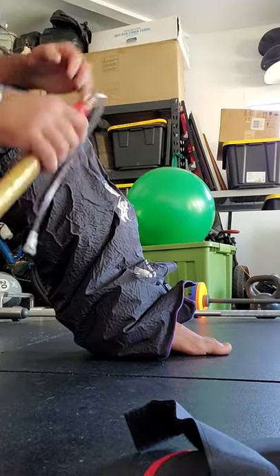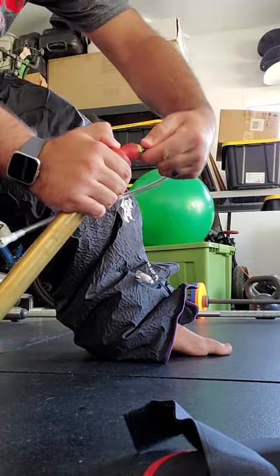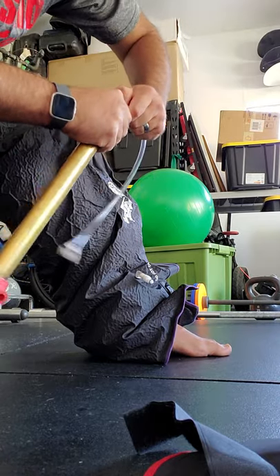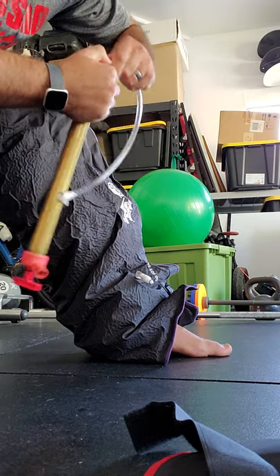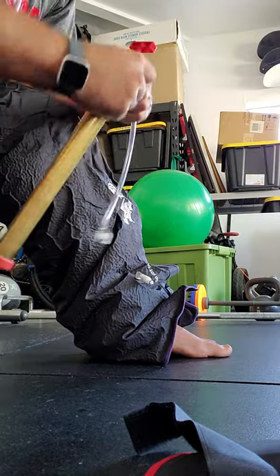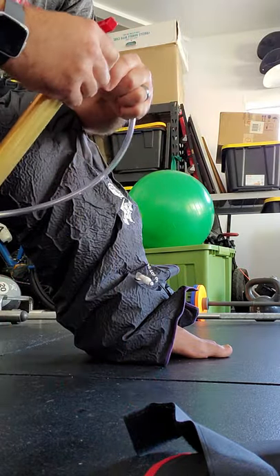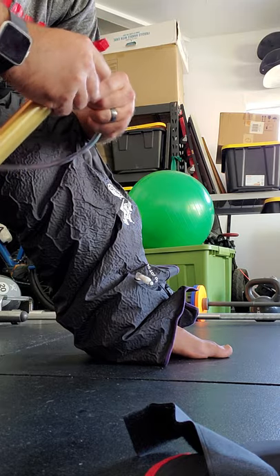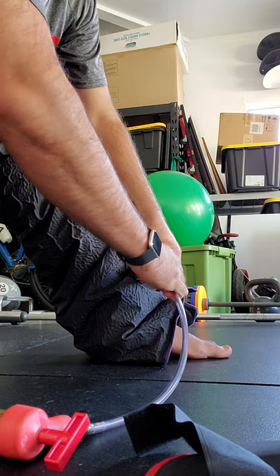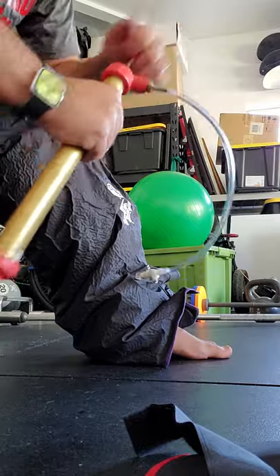To add air back in, on the pump I simply flip it to the other side — the top part — apply it back on the valve, and immediately air starts to go in. From there I can pump air back in.